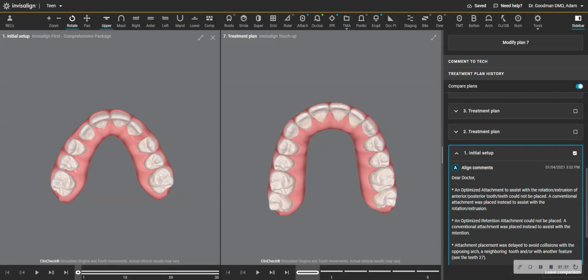They had a crowded mouth, and a lot of times people just automatically think palate expander is for a crowded mouth. Palate expander makes room. No, the palate expander gives a skeletal expansion of the maxillary arch when it is needed, and I didn't think it was needed in this case. So we used braces only to broaden out the arch. I used coil springs. I got the patient to this point, and now I'm actually using aligners to make those final last little changes, and the braces are now off.